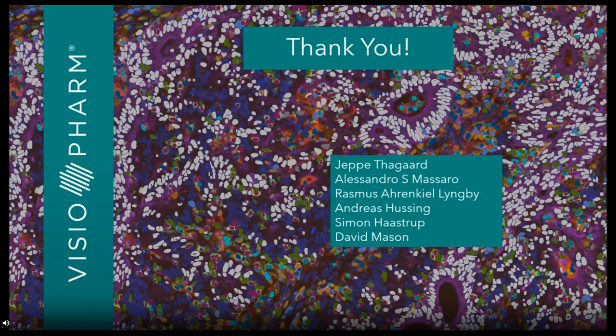Our next question is: is it possible to visualize and analyze any particular biomarker combination on aggregate data from different groups of tissues, e.g. tumors from treated and untreated tumors? Yes, if the assay is the same and the indication is the same, it is absolutely no problem to analyze this from different cases. So you can train the model on several images from the same assay and then transfer it to further samples and see how well it behaves on these samples.